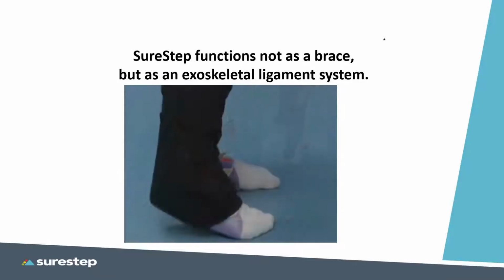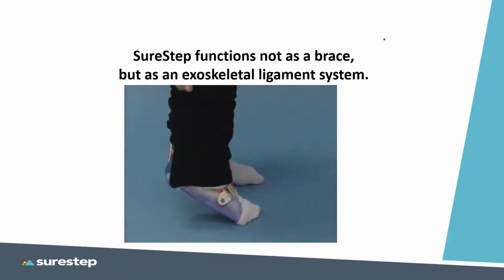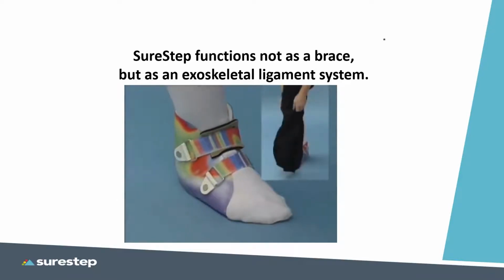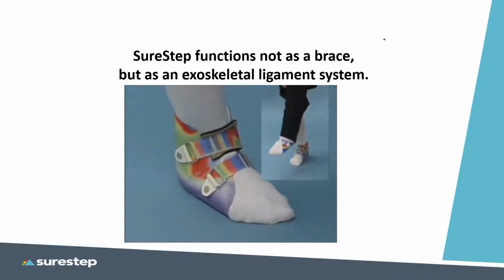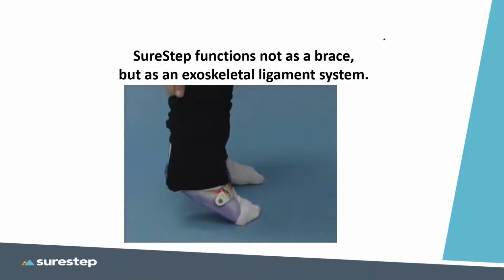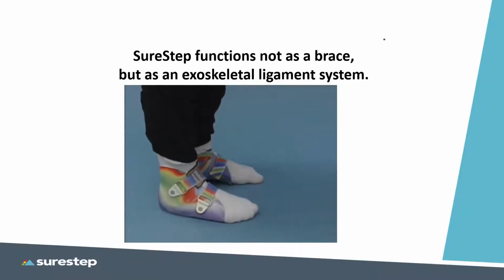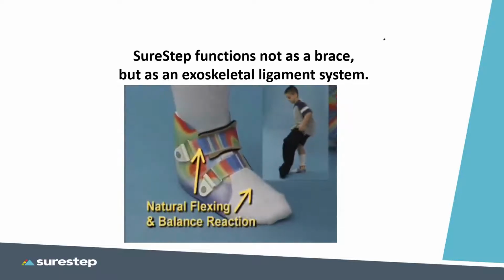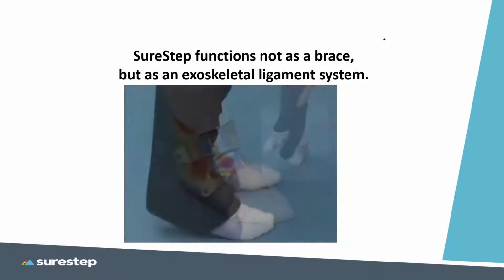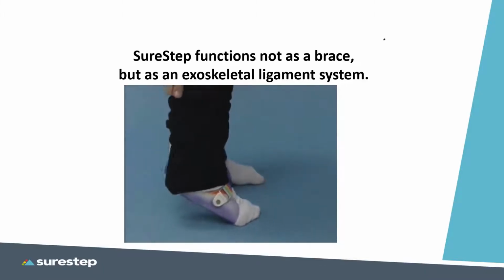Additionally, with this intrinsic movement, the joint receptors begin to function again. And once we get them into the SMOs and increase compression, we're really creating an exoskeleton deltoid ligament complex, and we're able to do the job of the ligaments within the foot and ankle by stabilizing the foot yet allowing for it to function more normally.